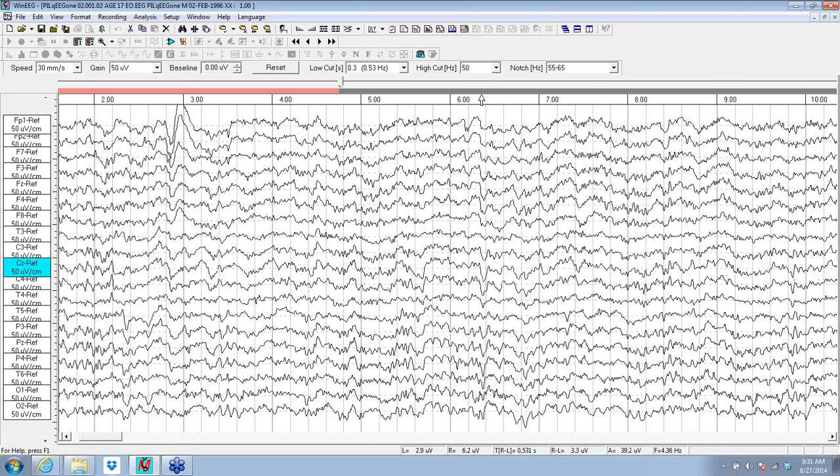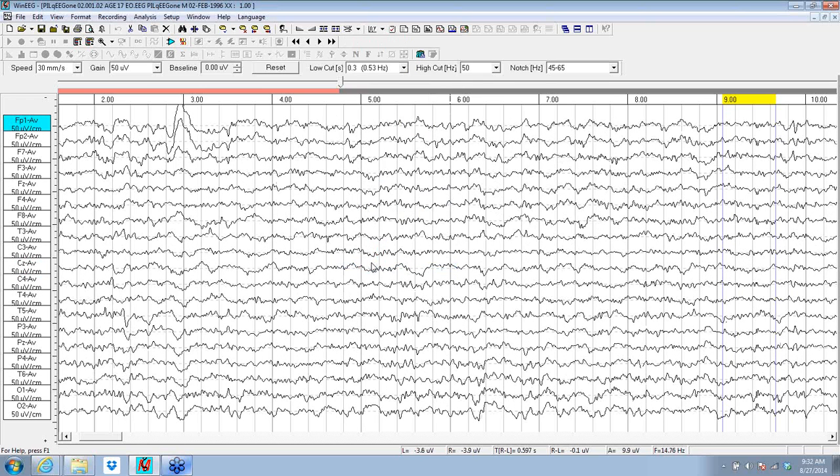Now, remember the last time we said when you start to see stuff that's in line everywhere, that's an issue with respect to the reference. And you can see the entire EEG has a slow dip here, and that little blip here. What we've got is, in fact, an ear reference issue. If we get away from the ear reference, the common, everything looking kind of halfway similar, like this, will all go away, and we'll see it a little bit more clarified.